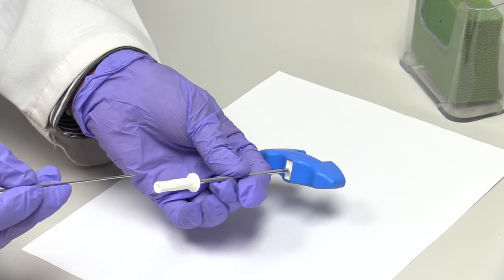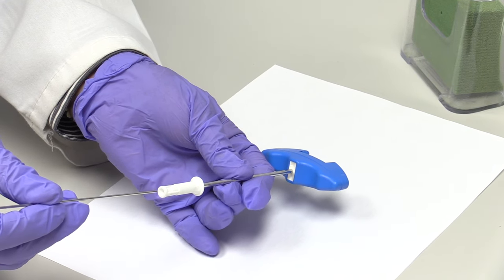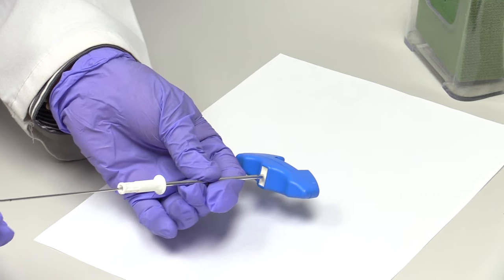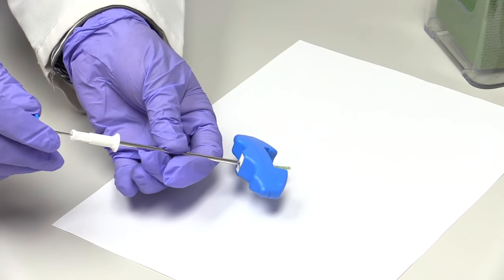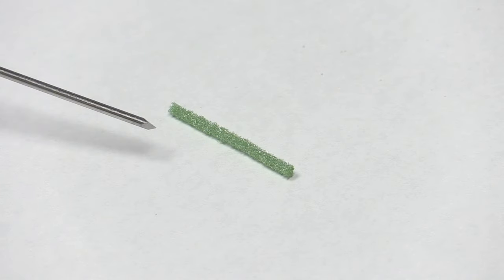To do this, introduce the pusher through the opposite end of the insertion aid. Gently push it forward to remove the biopsy specimen through the opposite end of the needle. Note the actual length and breadth of the specimen obtained by this needle.